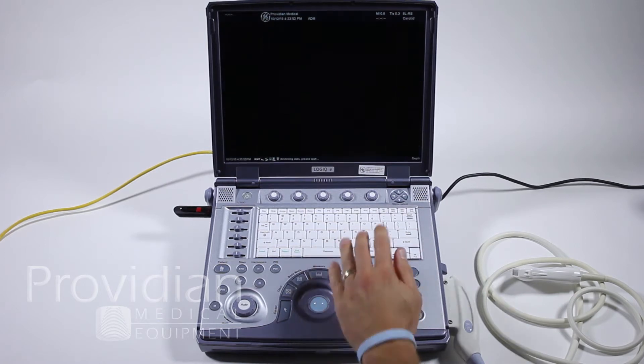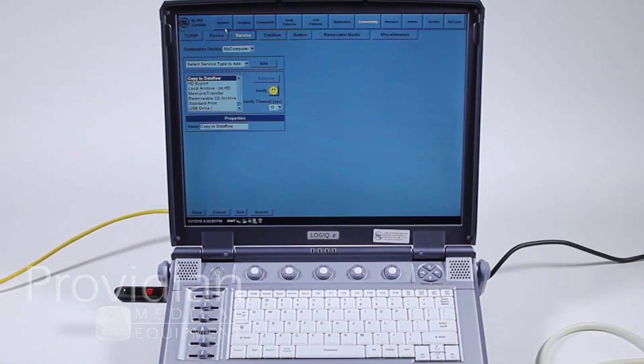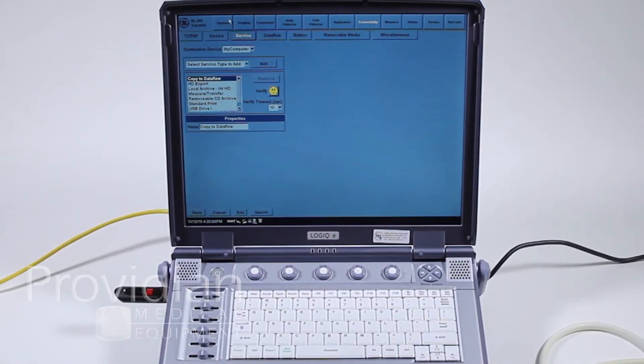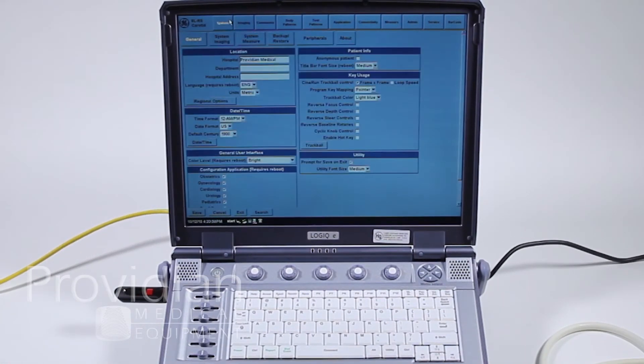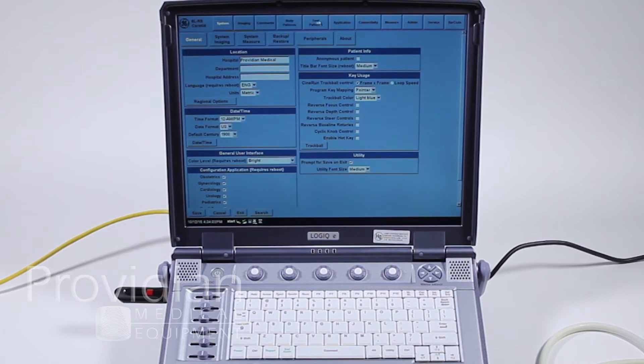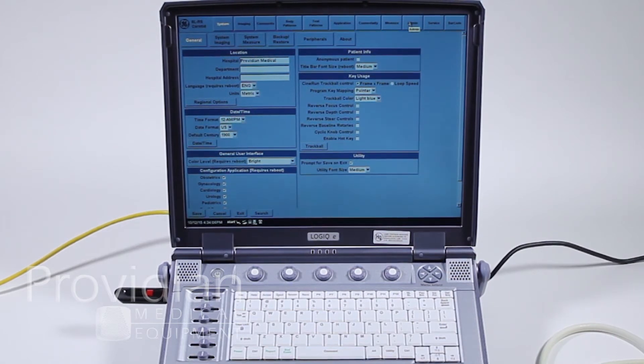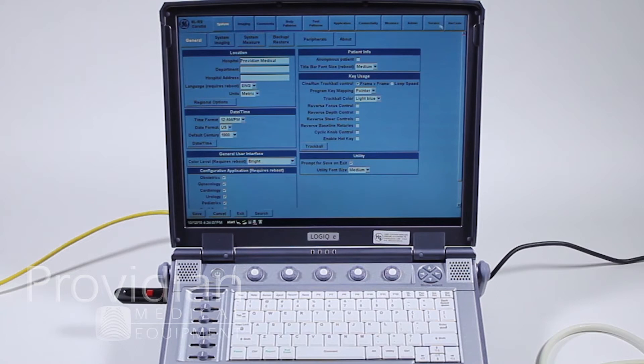We click on the utility screen and we've seen this a few times and we have a number of tabs across the top. These are the major categories up here: System, Imaging, Comments, Body Patterns, Test Patterns, Application, Connectivity, Measurements, Administration, Service, and Barcode.